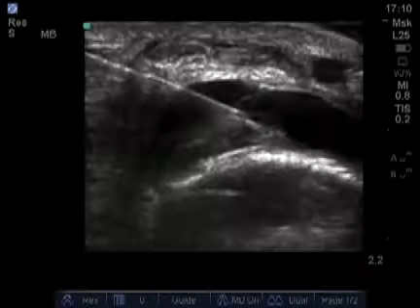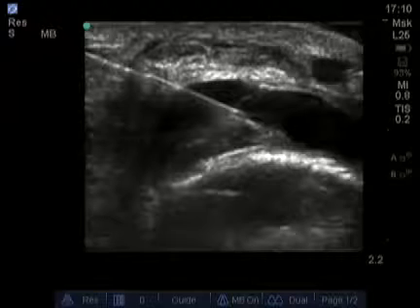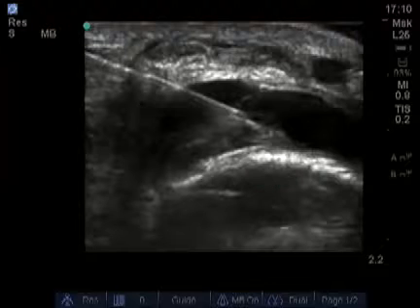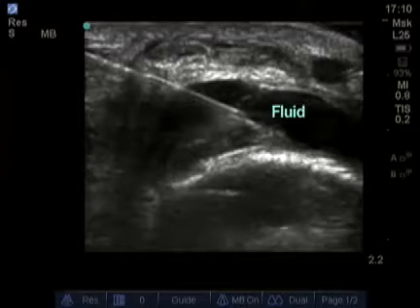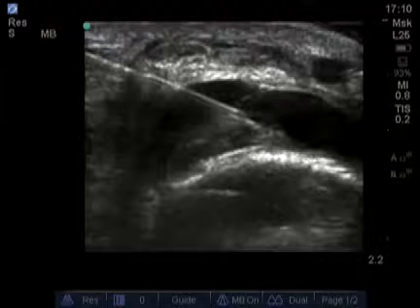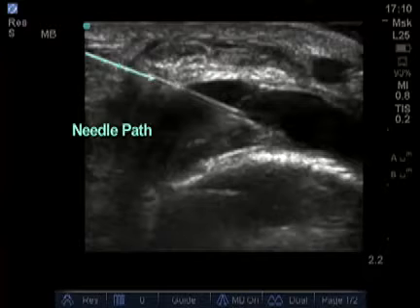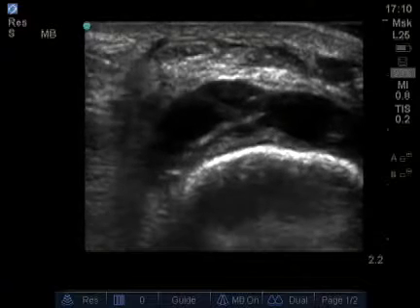This image is of a person with acute gout. We have a transverse image of the left first metatarsophalangeal joint. This is the bone surface — the distal end of the metatarsal. This area of hypoechoic and anechoic black appearance is fluid in that joint. There is a digital artery over here, and the needle can be seen coming down from the left side of the screen. You can see the bevel on the needle.